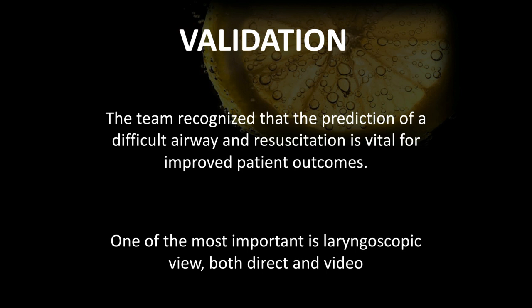So really what the crossover technique is you go in, let's say in a video manner, right? You're going to use your video as your first pass, but you immediately recognize you have so many secretions that's obstructing your camera view. You immediately bring your eyes down and now you have a direct view.